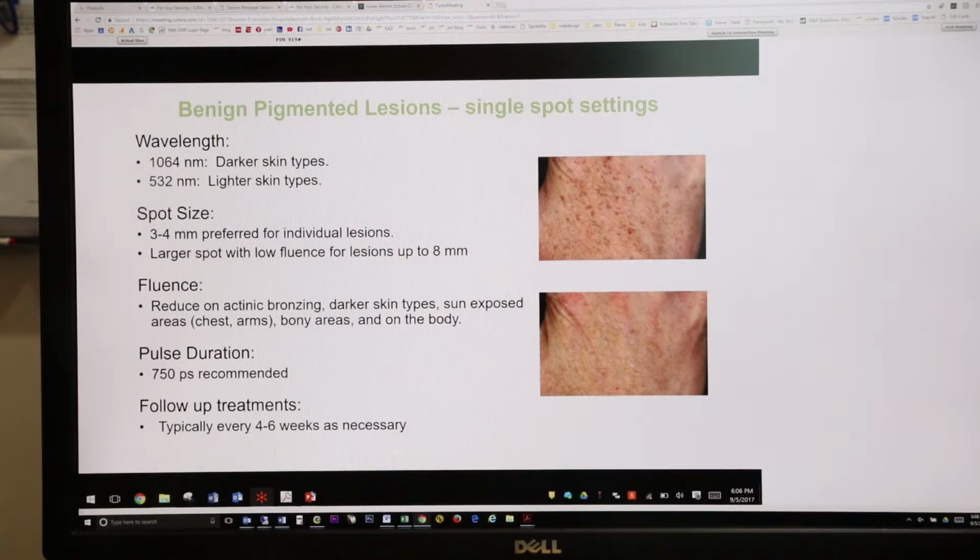And for a nevus of Ota, how many millimeter would you use? Well, we have a paper on it actually I can send to you, Dr. Ringfeld, but it's totally up to you. They are using basically tattoo settings for this nevus of Ota, depending on the severity.